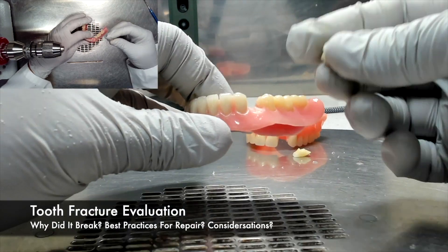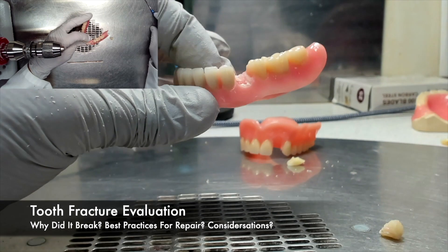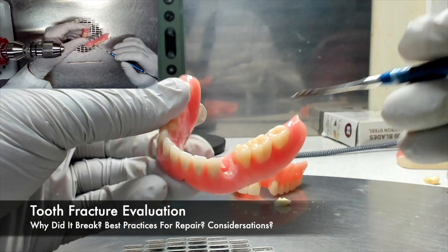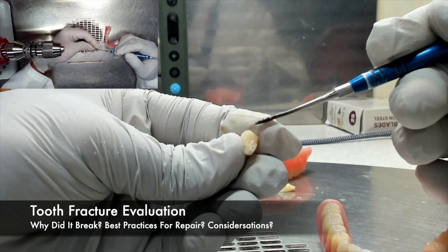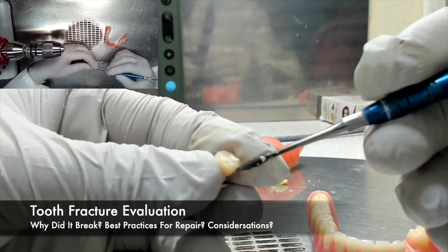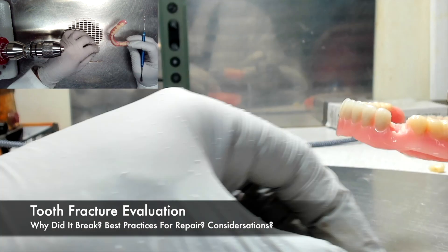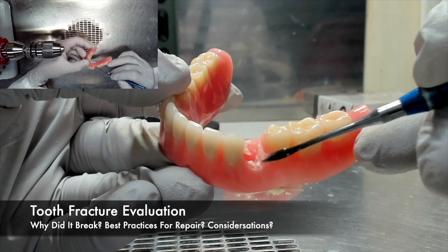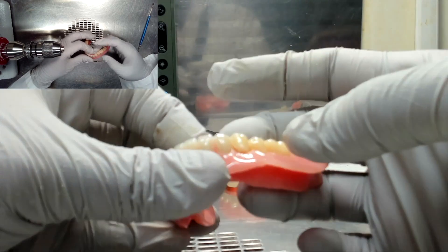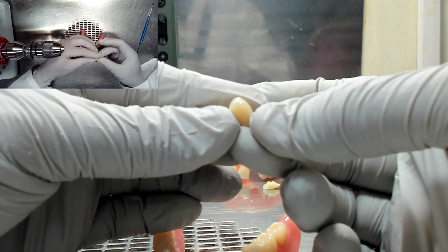When beginning the process of a repair, it's important to evaluate the tooth fracture itself. Ask yourself: why did it break, what is going to be the best practice for the repair, and what are the considerations? The Air Force Manual discusses two different categories of tooth fractures that can occur: one that has a clean de-bond where the gingiva is still intact, and another where the tooth has fractured off and some of the tooth is still in the denture base, resulting in the need to grind away the denture base.